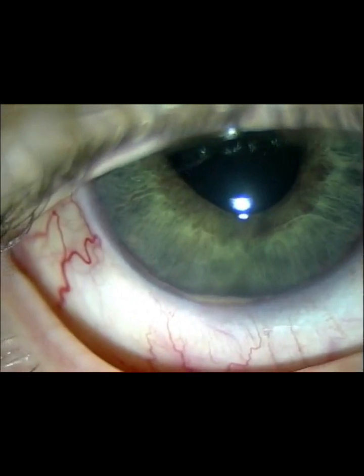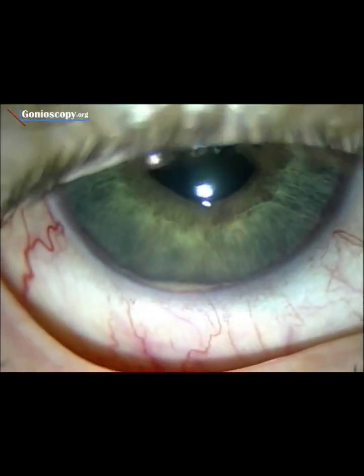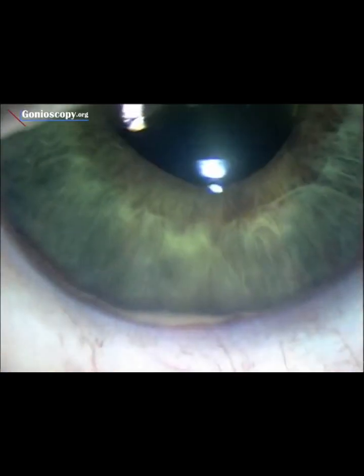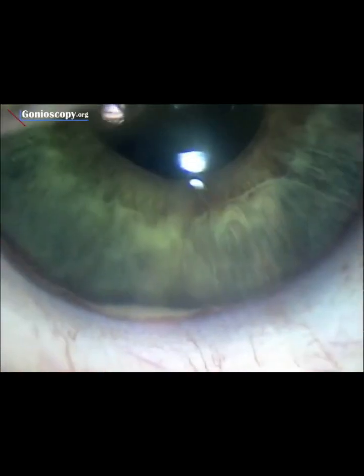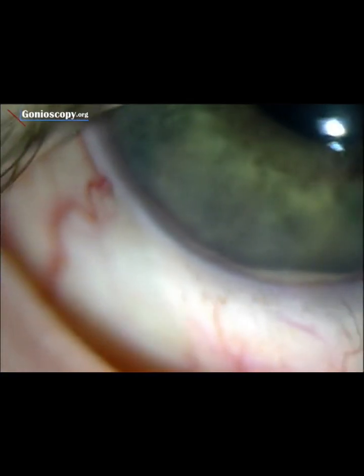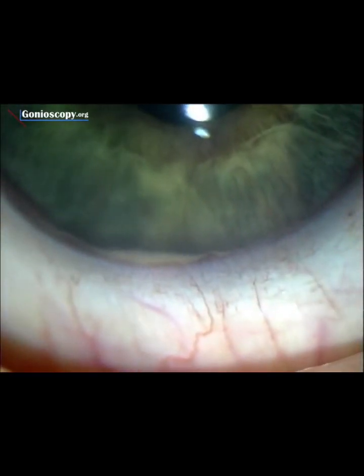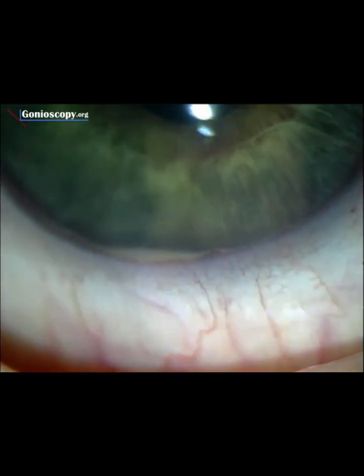This is a rather remarkable video of a 52-year-old man with neovascular glaucoma from juvenile diabetes. He's recently had corneal decompensation that is resolving, but this left him with a small hypopyon that is going away. Remarkably, you can see neovascularization that is visible on slit lamp examination as a red stripe in the far periphery. This goes 360 degrees around his cornea.